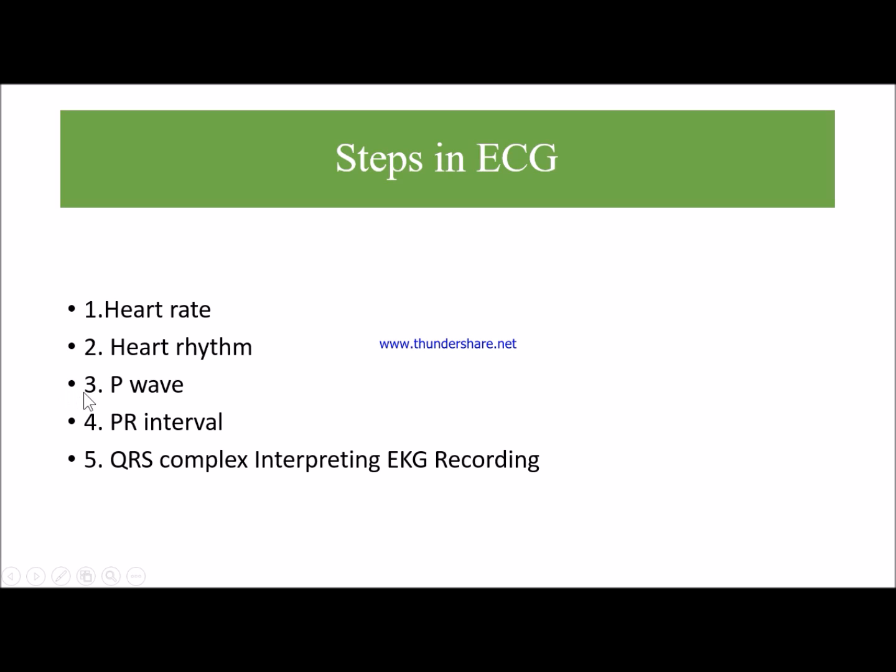The P wave is helpful during the investigation of a myocardial infarction patient or any other patient with cardiac abnormalities. The PR interval is always helpful in cardiac patients. The QRS complex is also helpful for the diagnostic procedures in cardiac patients.